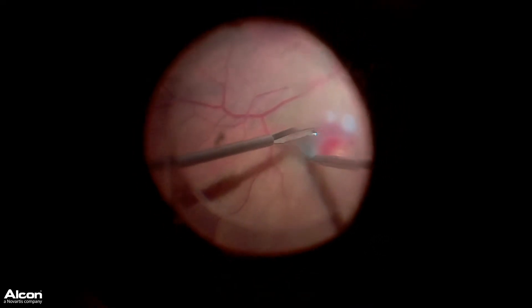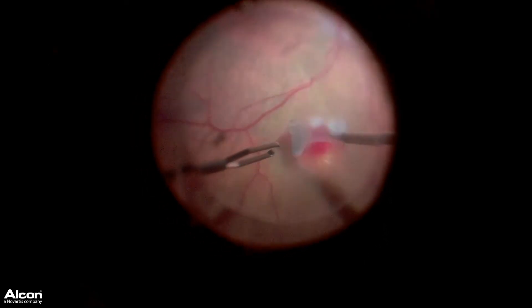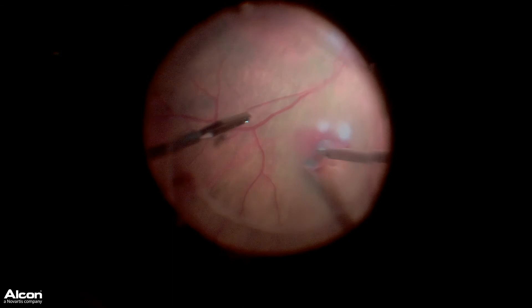You don't want to trim it completely at this point, or the fluidics of the eye will cause this retina to fly off and you'll lose your transplant.